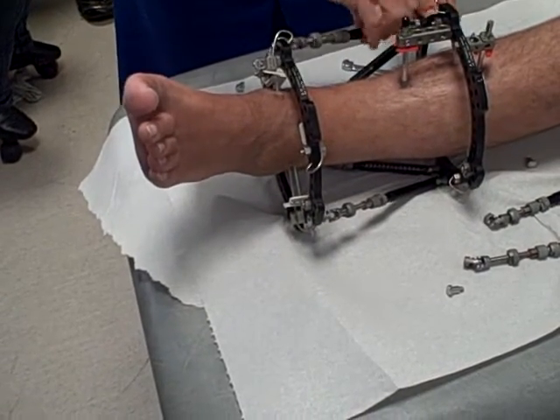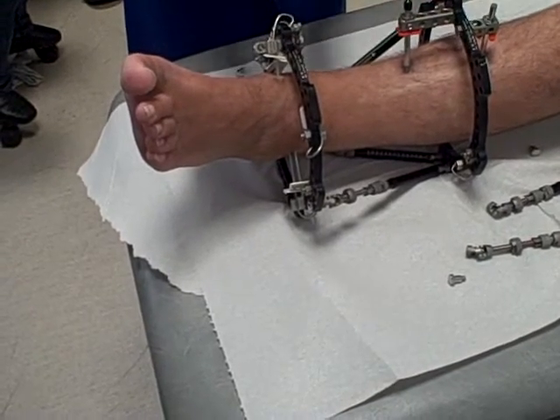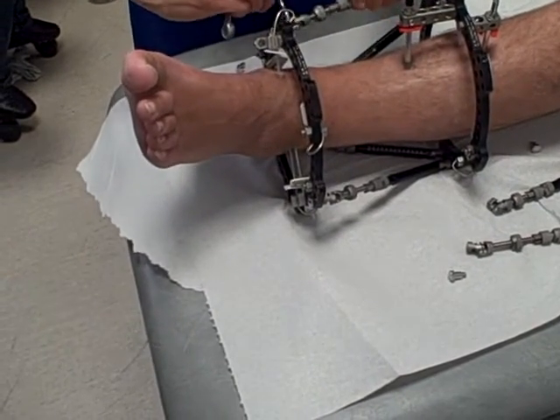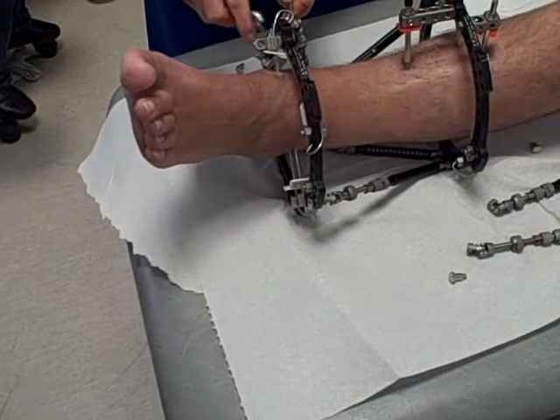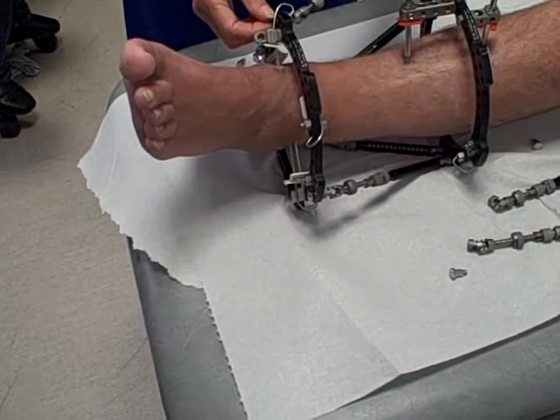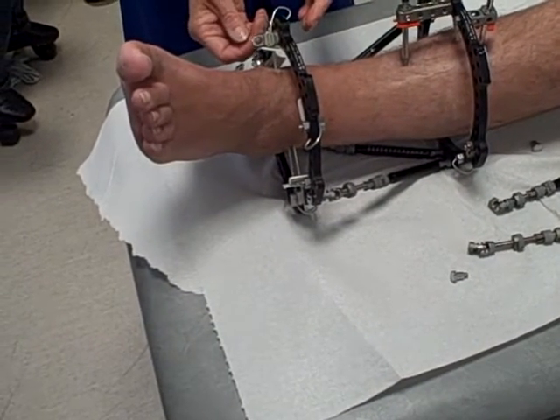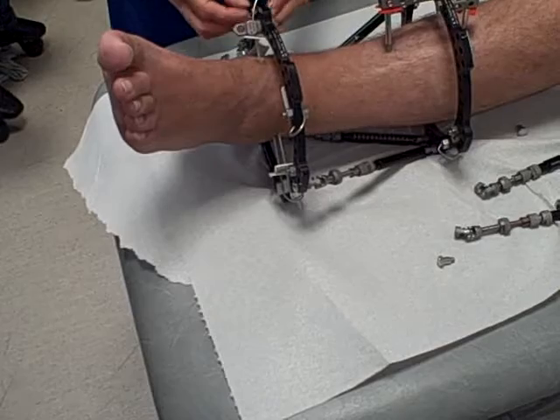You're flying solo then. And the purpose of doing it this way, John, of course, is that if it were painful and you weren't happy with it, we could leave these rings on. By leaving the rings on, we could just put the struts back on and carry on as we were before for a few months. But we're going to keep on taking the struts off.